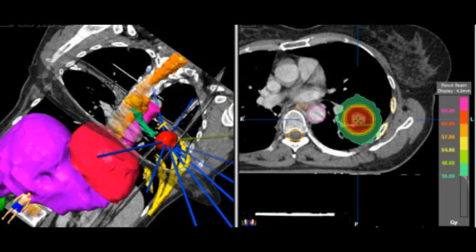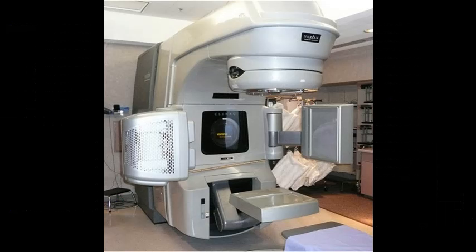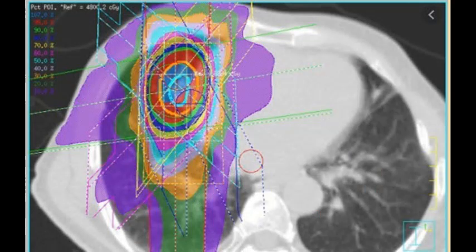So the potential for a geographic miss is higher. Therefore it is also accompanied with much more imaging throughout, say, the fraction. So the doctor may instruct you to use image-guided radiotherapy not once, but maybe in the middle of treatment as well, or maybe one initially before treatment is initiated, and then maybe a second one to verify the positioning again, depending on, say, the physician's preference. But the risk of geographic miss is high because of the reduced margins.